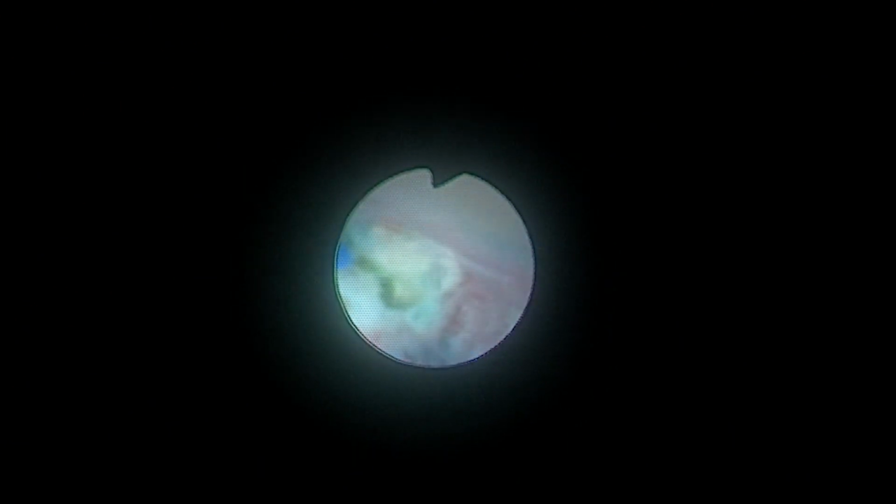We carefully opened the diverticular opening, and after a few initial laser bursts, we could see the stone there inside the diverticulum. And once we could see some stone, the opening was further enlarged to remove the stone from the diverticulum.